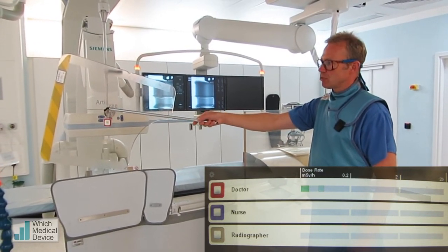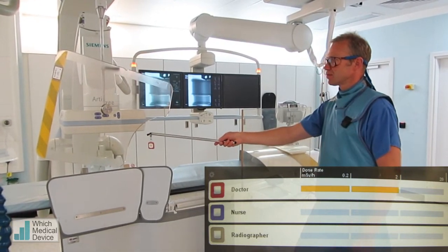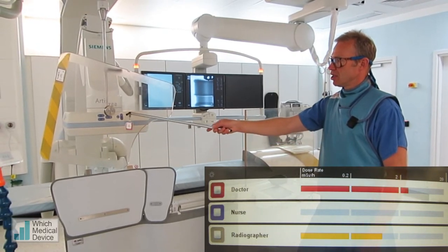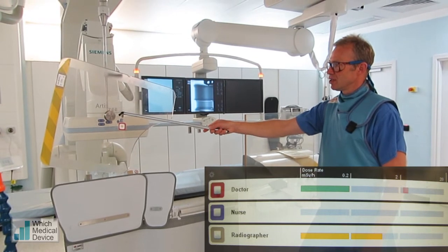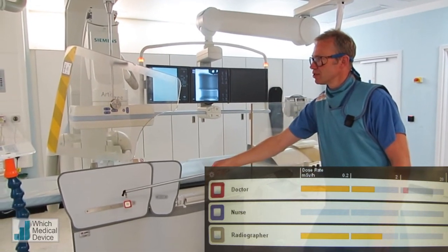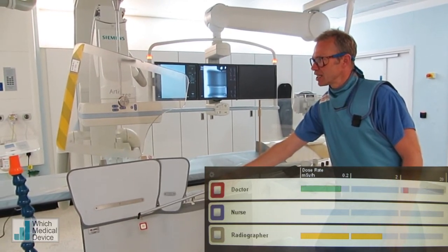Now if we just do a digital subtracted run again, let's just look at the difference that makes. So here we're certainly up into the red, and behind the screen it's gone right down into the green, and behind this screen it's dropped right down into the green again.